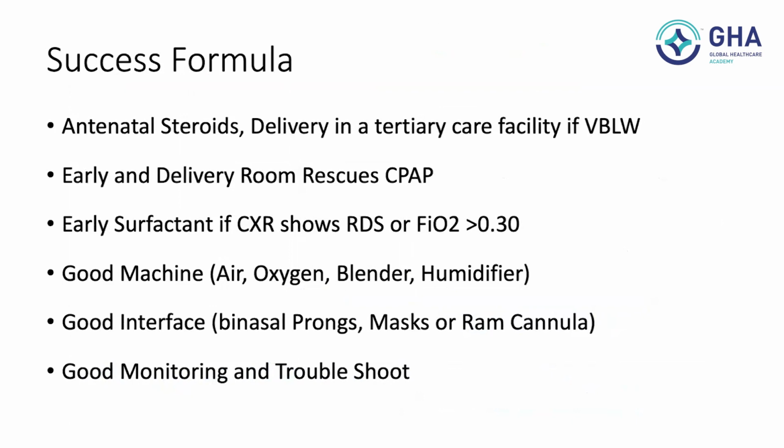Baby less than 35 weeks, distress, Silverman score more than 3, start CPAP. Don't look at anything else. Surfactant, if the baby is on CPAP, if FiO2 is more than 30%, X-ray suggests RDS, give surfactant with CPAP. You can avoid failures. So have a good machine, good interface, good monitoring and good troubleshooting.